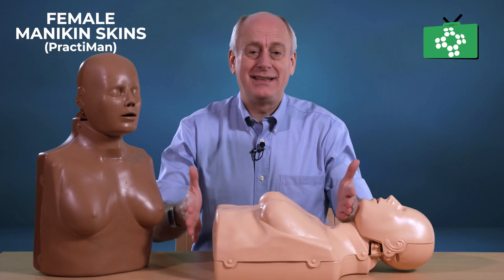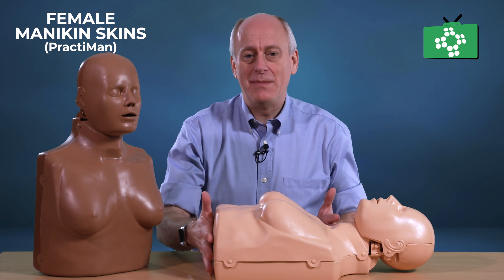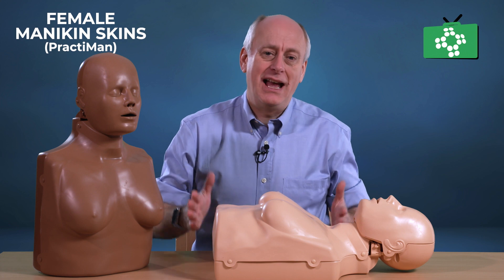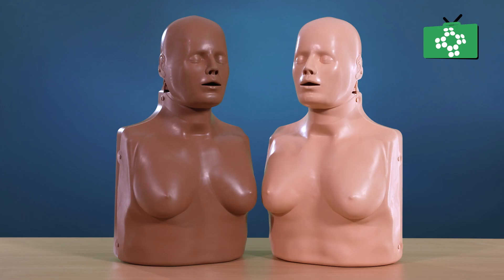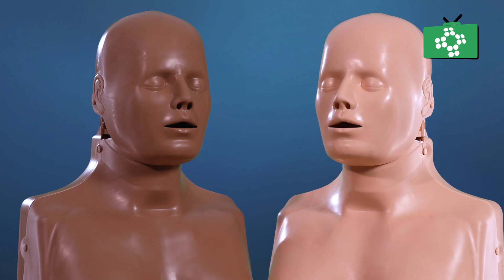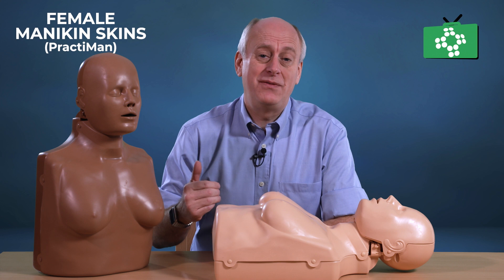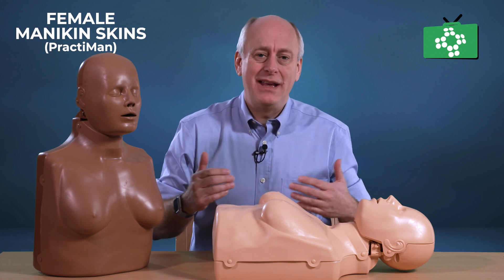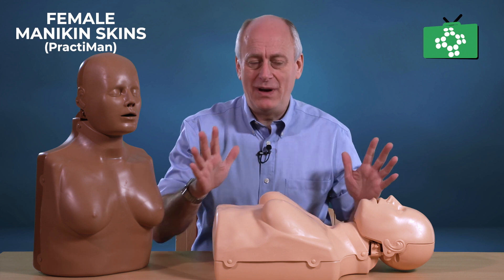In this video, we want to look at the skins that can be put onto mannequins for females. What these skins are is you can remove the existing skin and put a female skin on. Why would we need female skins? Well, obviously half the population is female, but also survival rates where people are actually attempting CPR on females is lower than it is with males. So if students are practicing in the classroom on a female skin mannequin, they can see both ways of doing it.